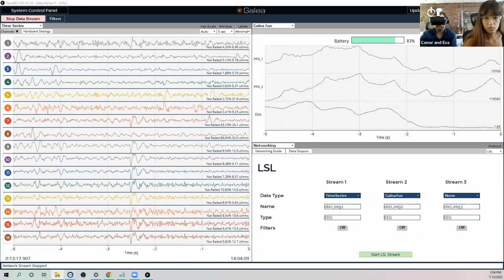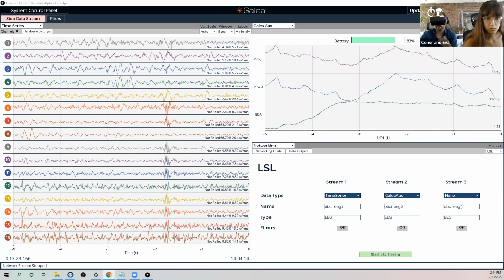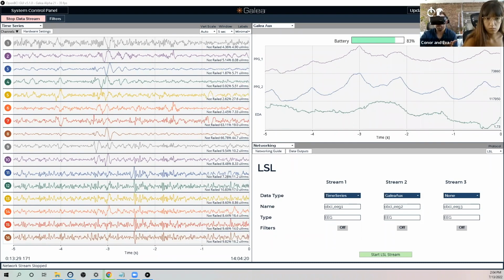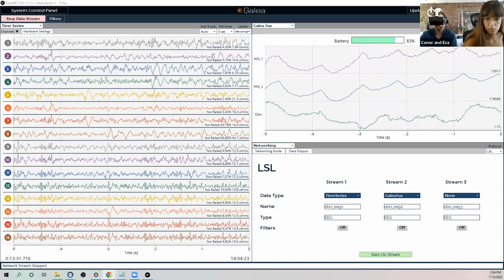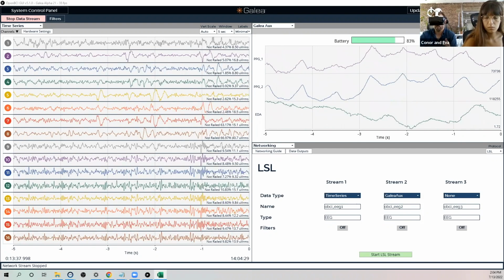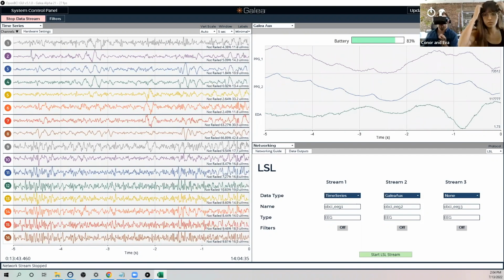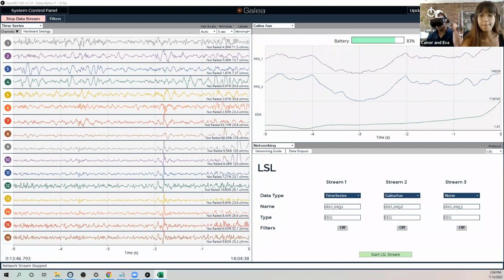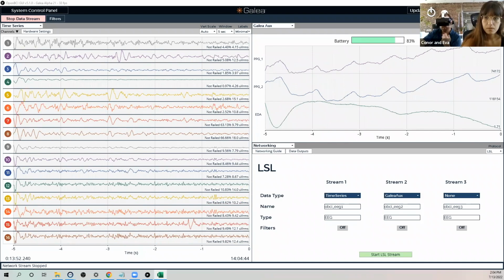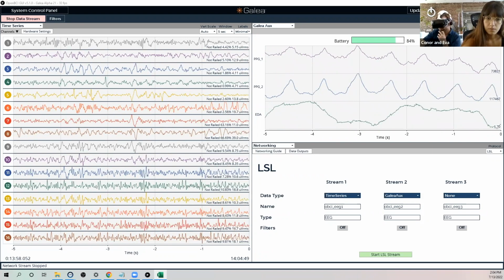But when you're designing a headset to be a dynamic system to adapt to every head size and every head shape, it's a very, very challenging task to implement the right number of mechanisms where we still keep the setup time down to a minimum, but also allow the adjustment mechanisms to exist for different head sizes and shapes. So that's definitely an optimization problem that we are still improving the headset for. But I think we've made some really, really good inventions and designs even for the alpha devices, and it should only get better for the beta units. Cool.